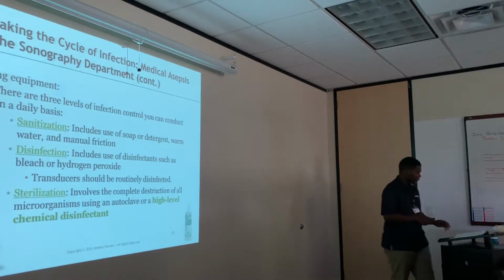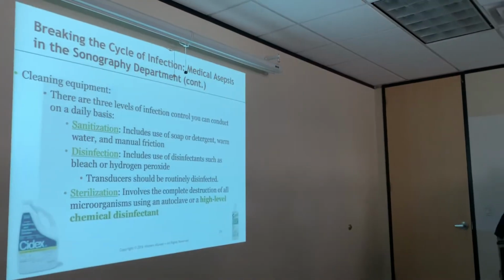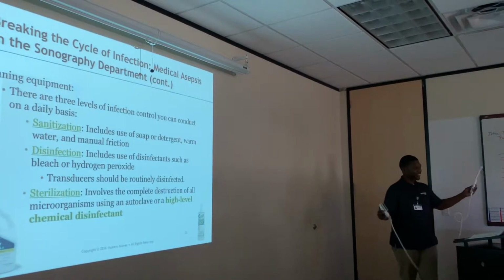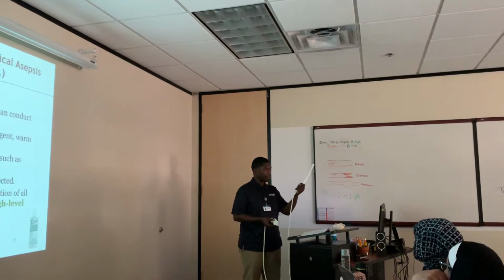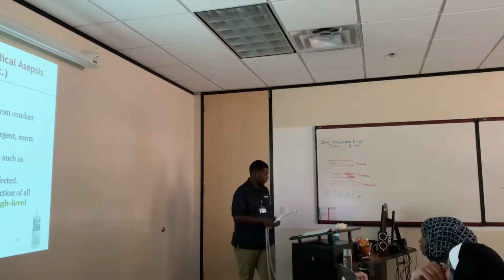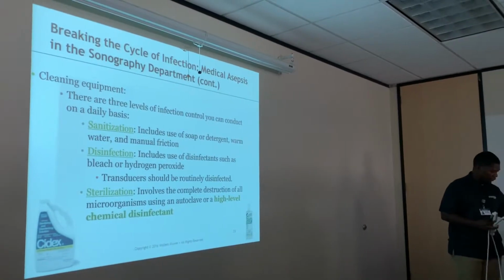Okay. So when we're talking about sterilization, back to that, we can't use the autoclave on our transvaginal ultrasound, right? Because the autoclave is what, Myra? No. The oven, right? It's the oven, so it's too hot. We're going to damage our PZT elements, and not only that, we might damage the plastic on the transducer. So we can't use an autoclave. So we use other solutions like a high-level chemical disinfectant, like Cidex, guys. That's what we use to clean our transducers.